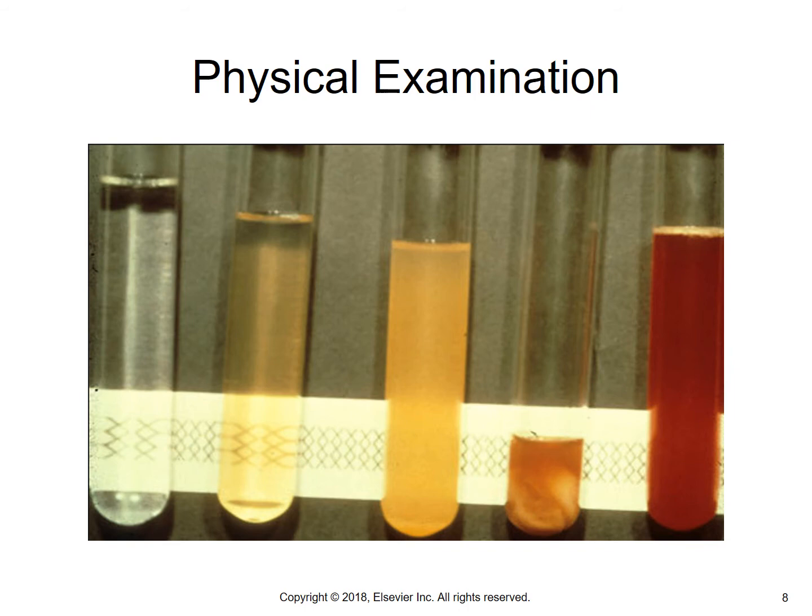Now, as for clarity, there are a number of substances that could modify the clarity of them. First, it would be the cellular elements such as red cells, white cells, synovials, fat droplets, and rice bodies, which are just floating little pieces that look like rice, and they can be causing some kind of turbidity in the identification of the microscopic exam.